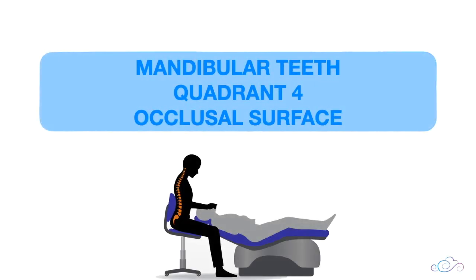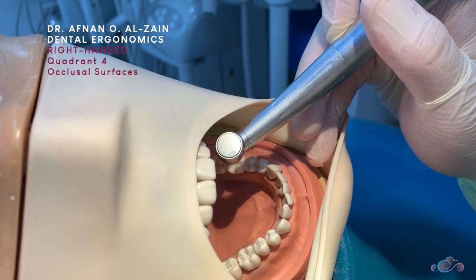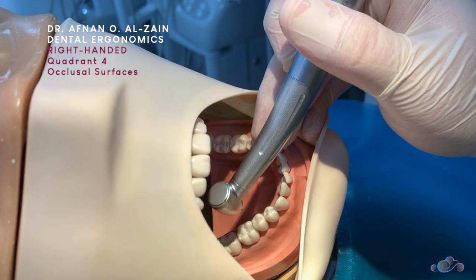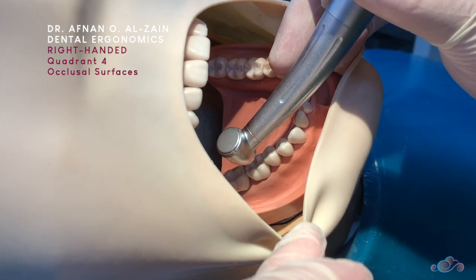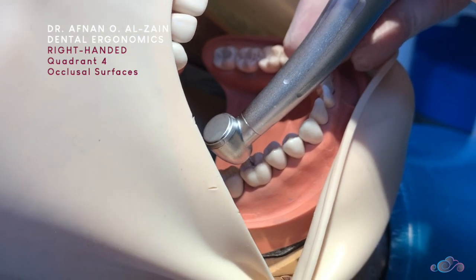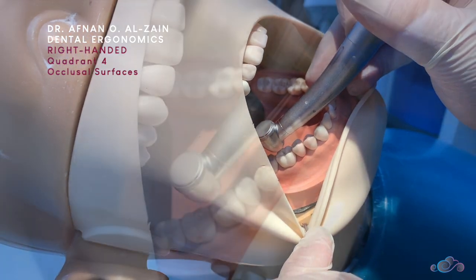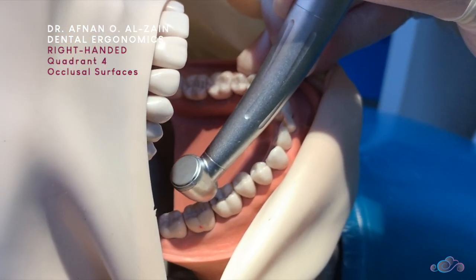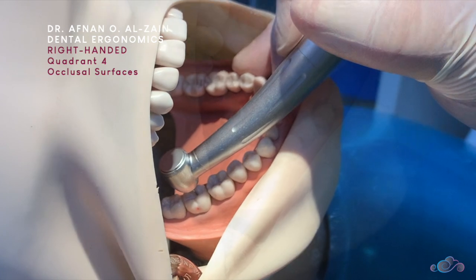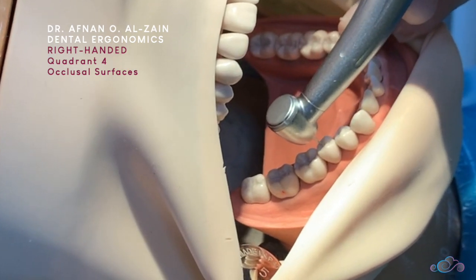Moving to the occlusal surfaces of quadrant four. To work on the occlusal surfaces of quadrant four, it is a similar position to quadrant three. Place the handpiece perpendicular to the surface, place proper finger support, and make sure you can see clearly. If you can't, tilt the dummy head a little bit until you can. Use the mirror to retract the cheek or reflect the light. If working on the second molar, extend your fingers a little bit to reach, keeping the burr perpendicular. The same applies for the premolar — maintain proper finger support.